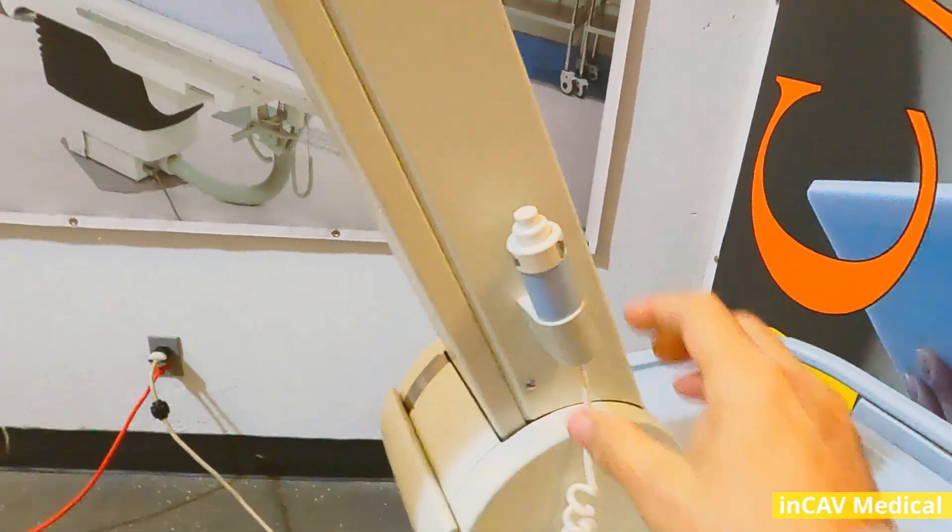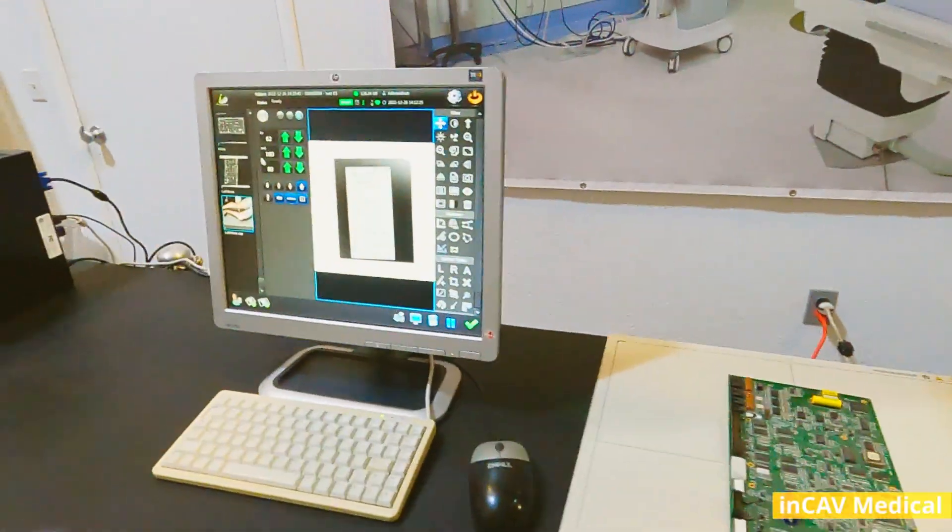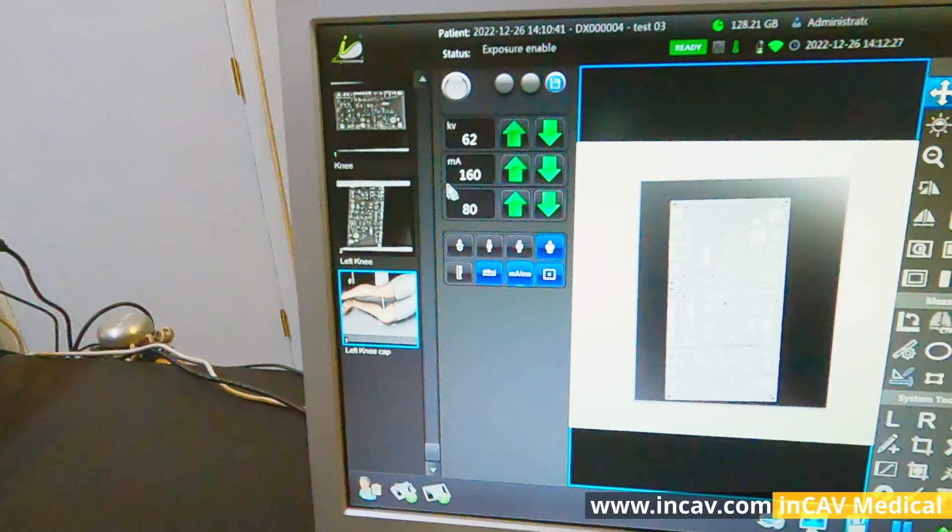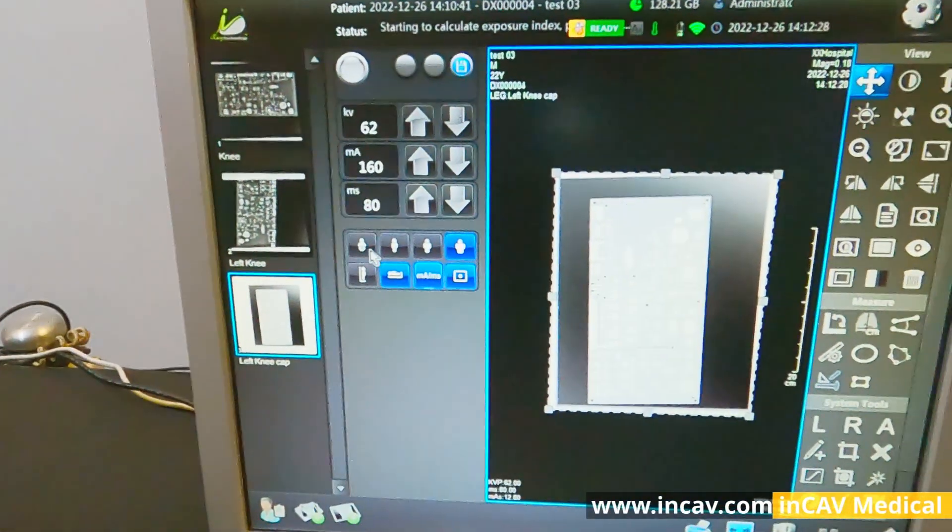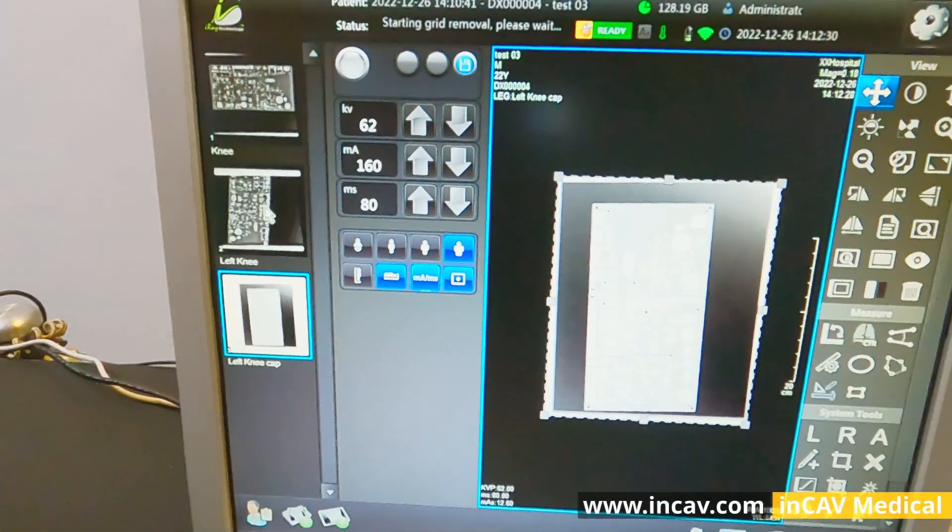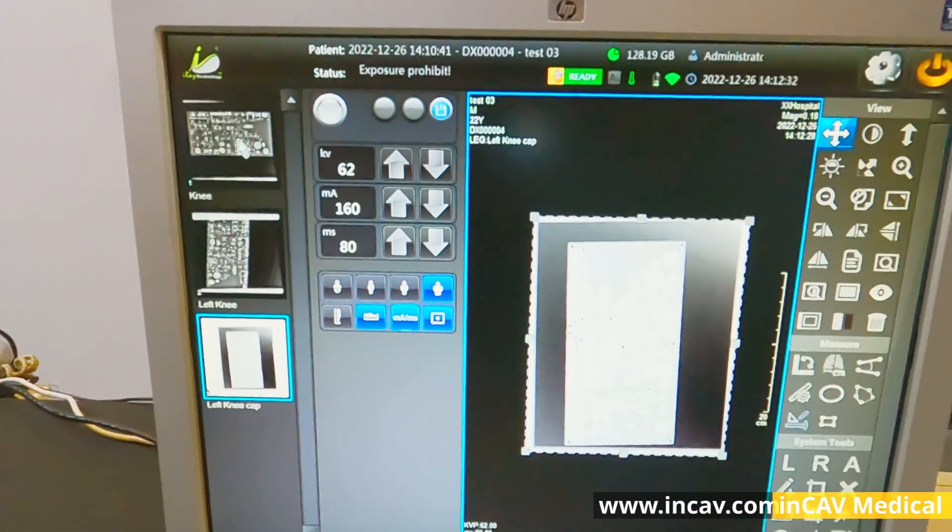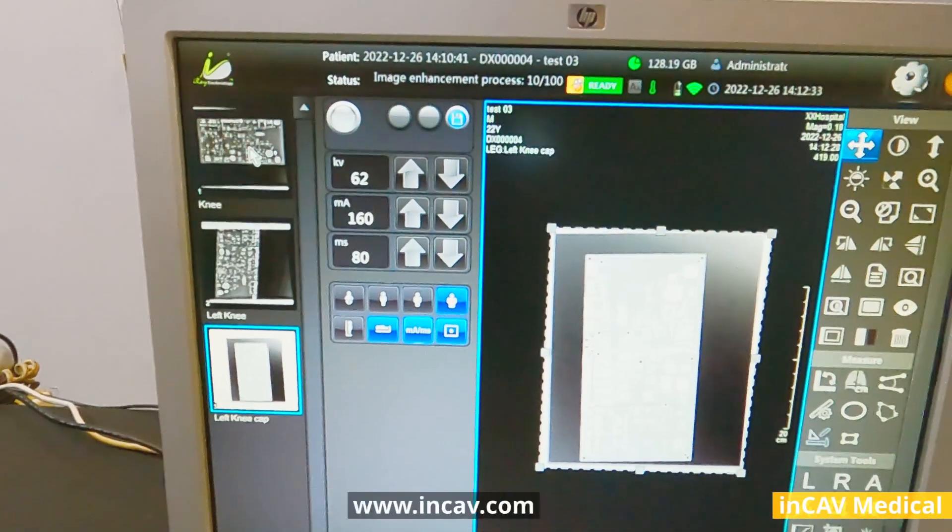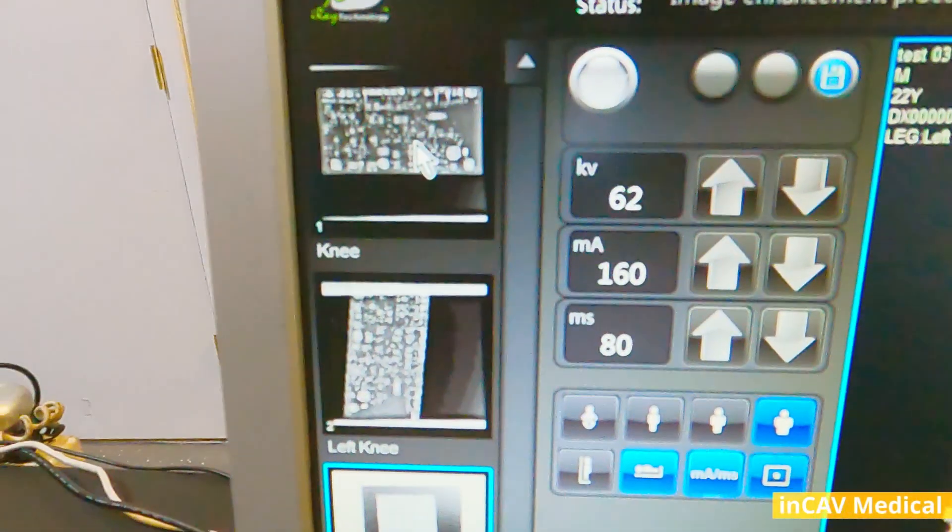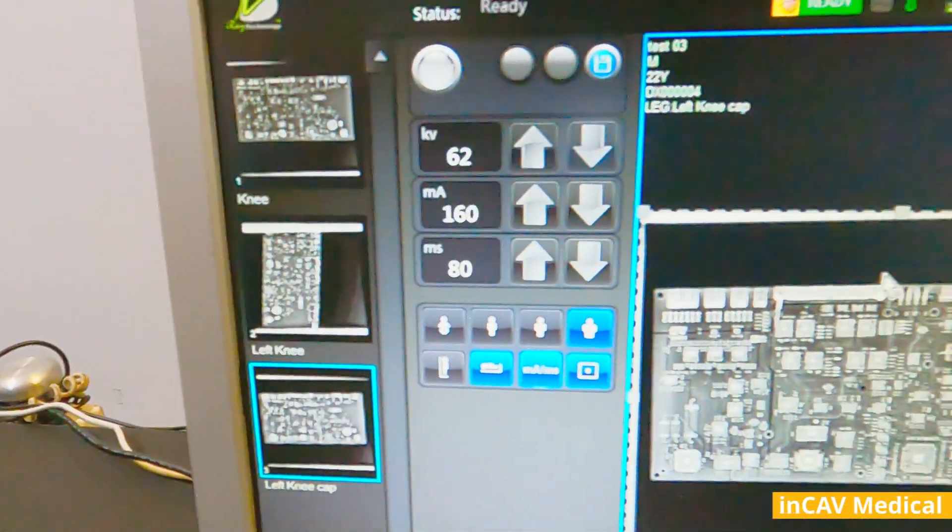We can put the x-ray hand switch away and start post-processing the images with all the tools available on the software. Here we have all three images that we just took from our patient. Just click on the image you want to edit.